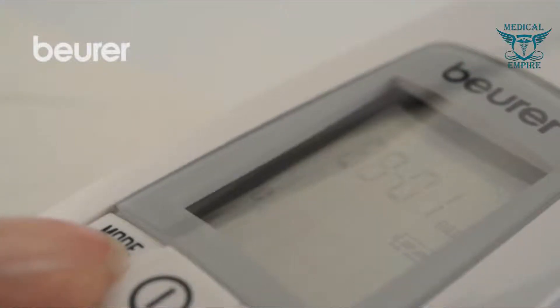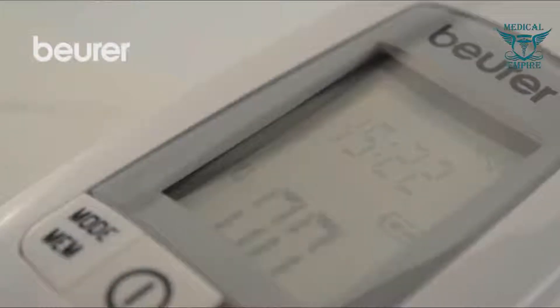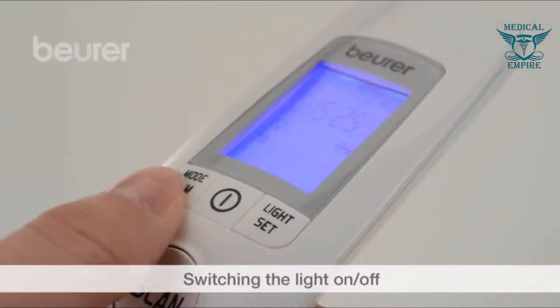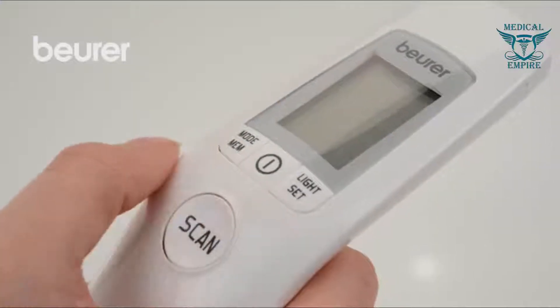Proceed as described above to set the year, day and month, time and unit of measurement for temperature, and set the symbols for the acoustic signal and light to on or off. Press the light set button to switch the light on manually. Switch off the device to complete the device settings.